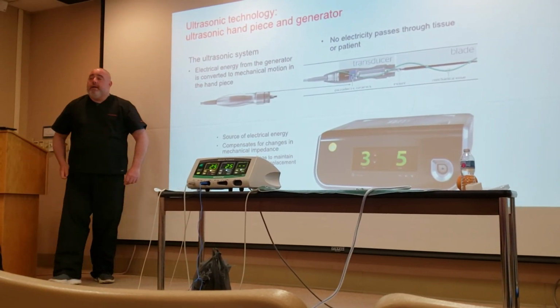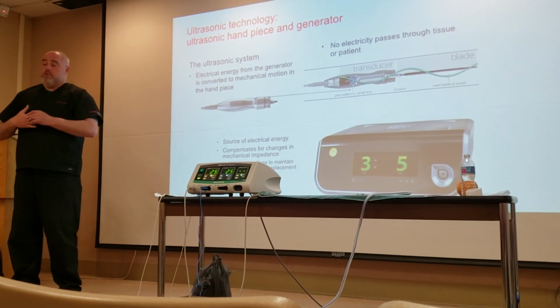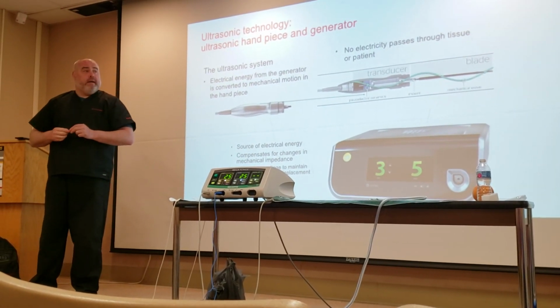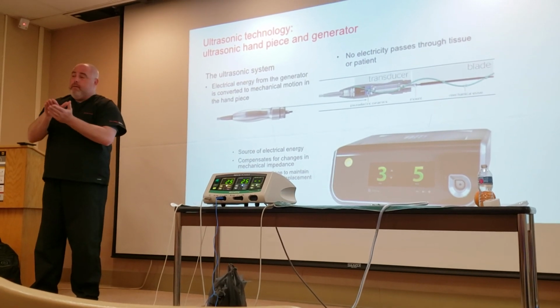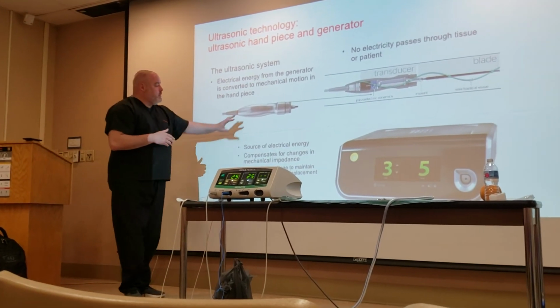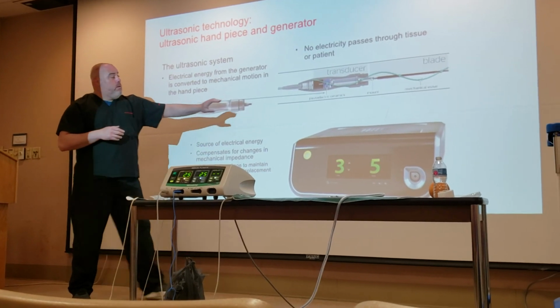Ultrasonic technology is another advanced form of energy that's used in surgery. We talked about monopolar, bipolar, advanced bipolar. All of those are using electrical current at the tissue. Ultrasonic transforms electrical current. This is a handpiece that is attached to a device.